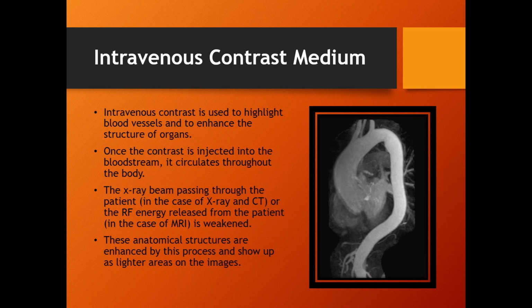There is a long explanation. To really understand it, it gets deep. But basically, the thing in your body that makes the images, long story short, is the hydrogen atoms in your body. And gadolinium basically dampens the effect the RF pulses on your body have on those hydrogen atoms. That's how it does it. Simple. I don't know why they didn't come up with it years ago. All right. Any questions so far?